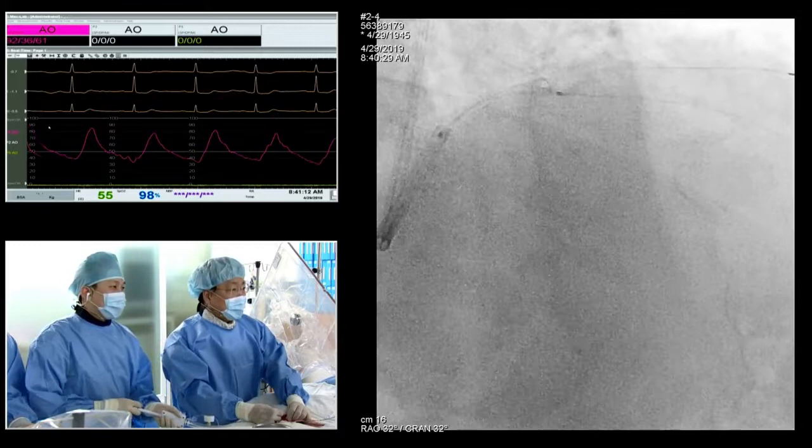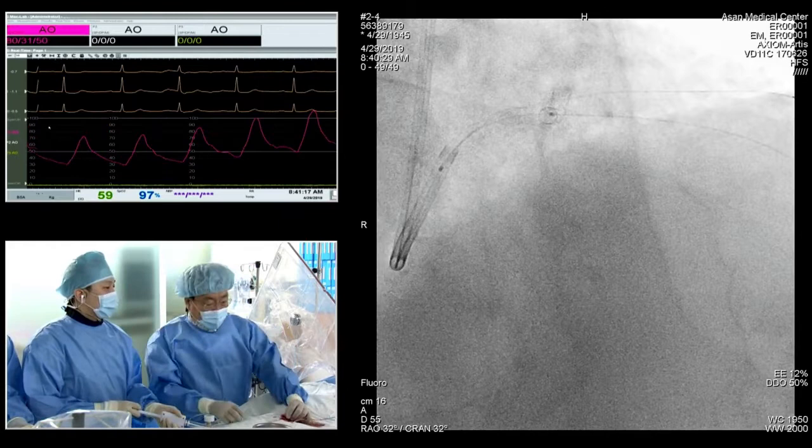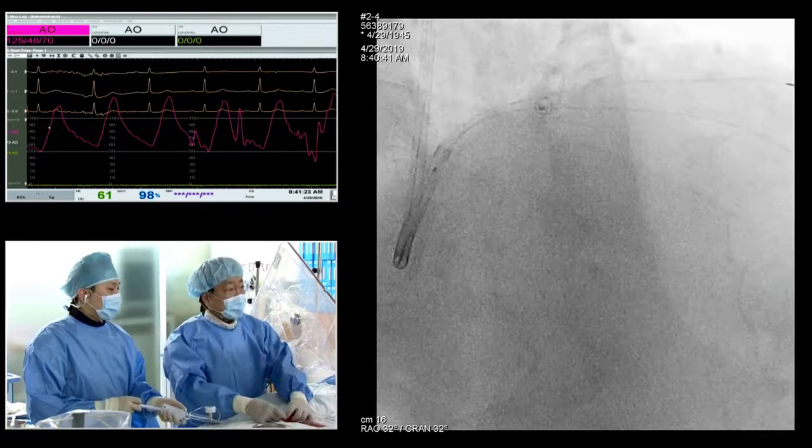No. Actually, I don't believe there is a stent difference, especially for the main PCI concerns. We compared many randomized studies and registry data side by side. In the case of a second generation drug-eluting stent, I think there's no difference at all.